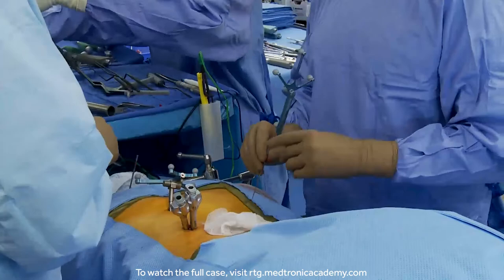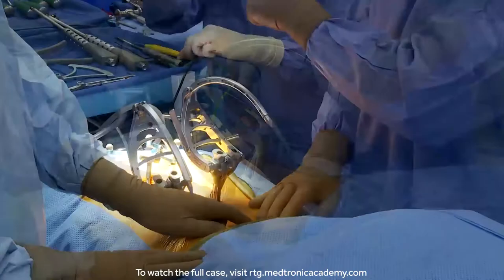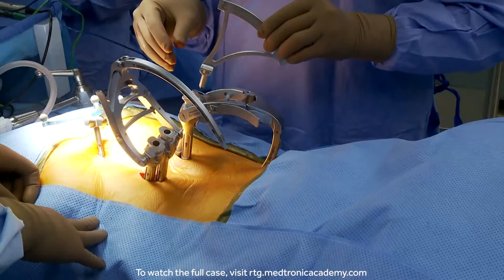So at this point, we have to find our L5 pedicle, and I can feel the ridges in the bone of the tap, and so I can feel it engaging bone nicely. So what I'm gonna do is I'm gonna take this arc, and I put it down the little tract I've created, and I pass it all the way down, and I can feel it hitting the first screw extender, and then we're gonna measure our length here.